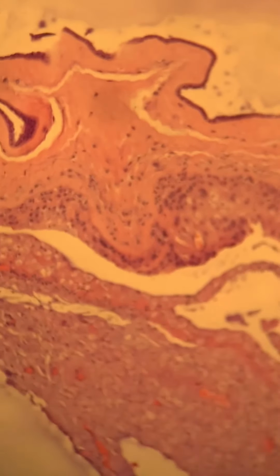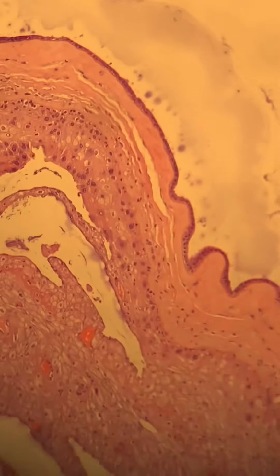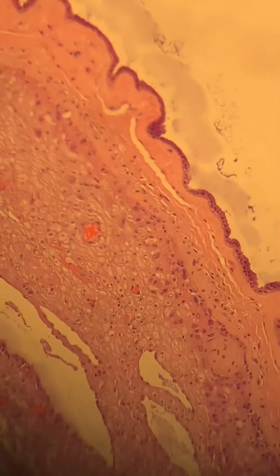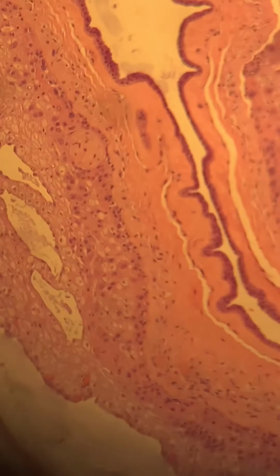But anyway, you can see some acute inflammatory cells right there early on in the membrane. It's very early, but there's definitely some acute inflammation right along that chorion. And on the amnion surface, there's slight fibrosis there. And you can see some meconium histiocytosis there.